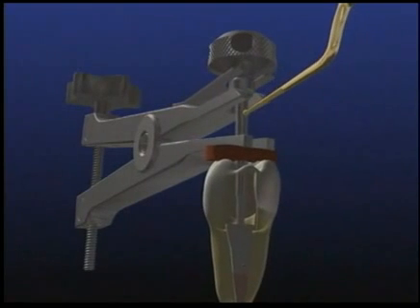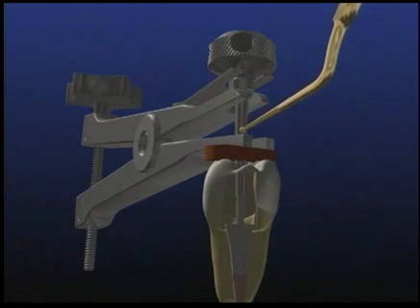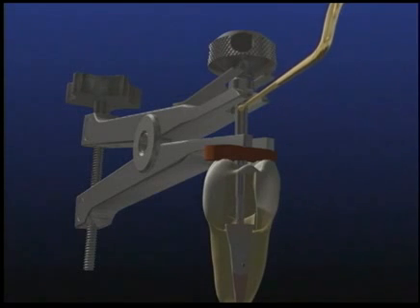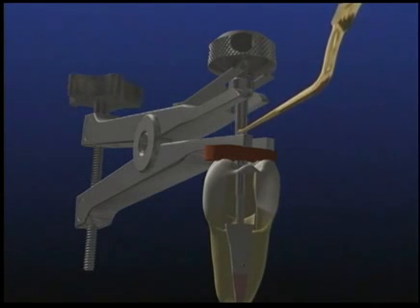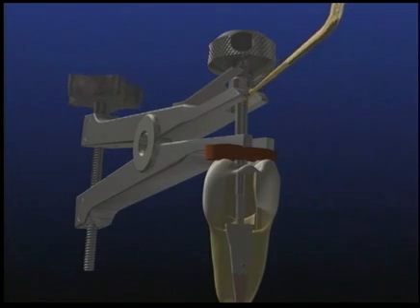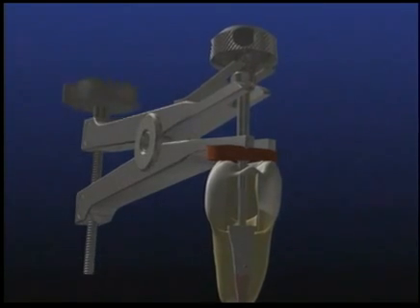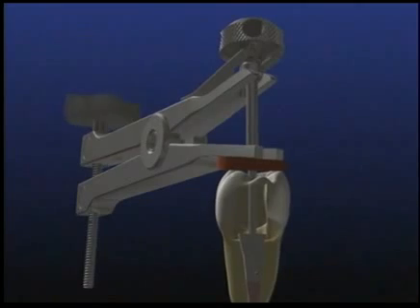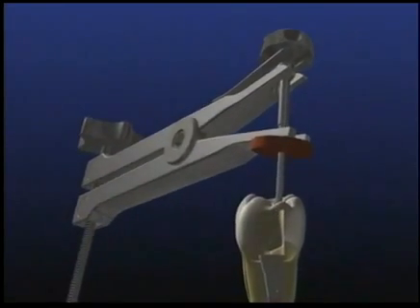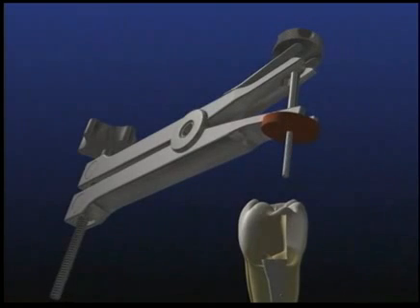If the screw knob becomes difficult to turn, place and activate a Pro Ultra Endo 1 ultrasonic instrument directly on the post-engaged tap. Ultrasonic waves of energy transmitted to the post will allow the screw knob to turn with greater ease, which in turn progressively separates the jaws of the extracting plier. This action promotes the safe and controlled liberation of the post. Ultimately, the PRS provides clinicians an important post-removal method that is employed when ultrasonic techniques are unsuccessful.